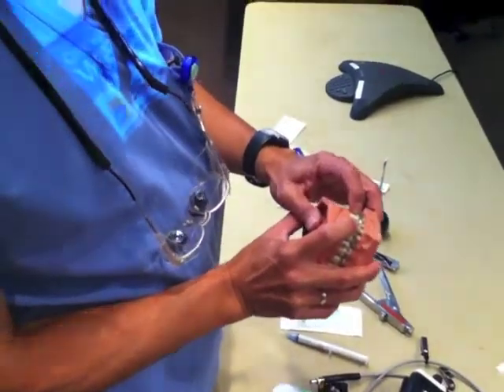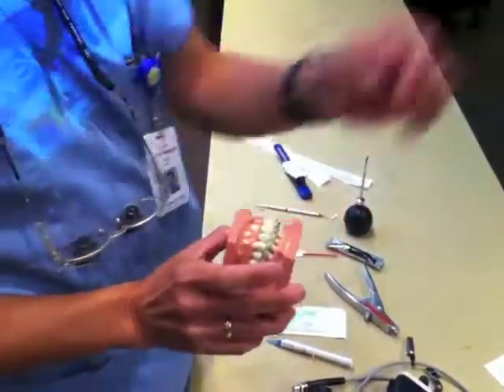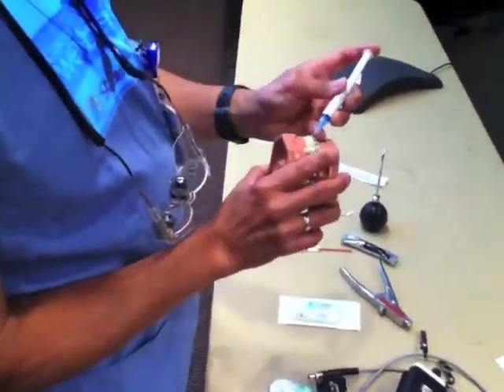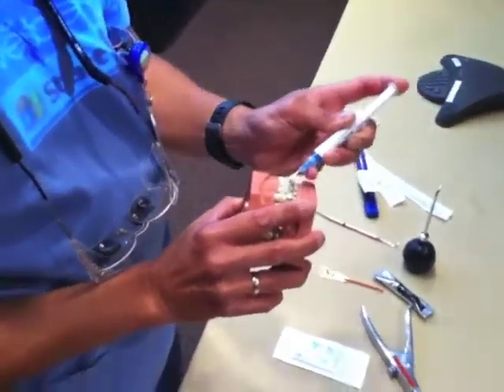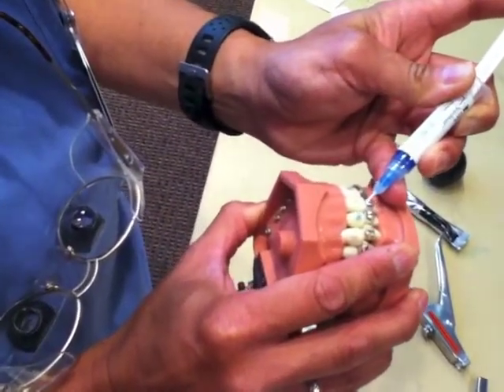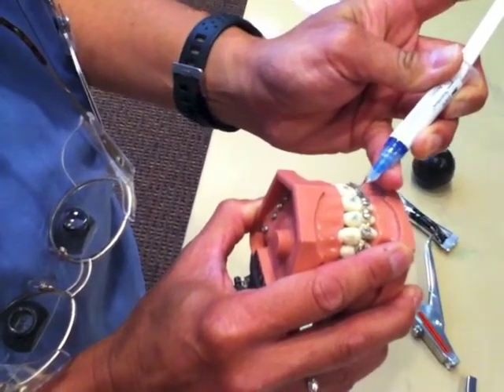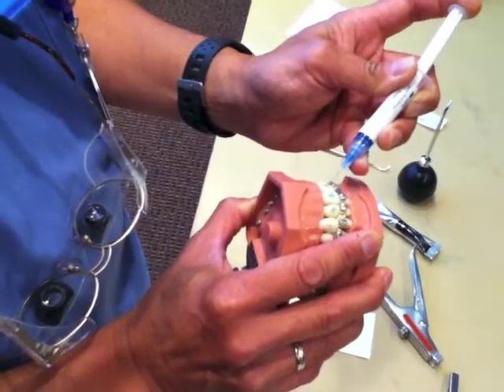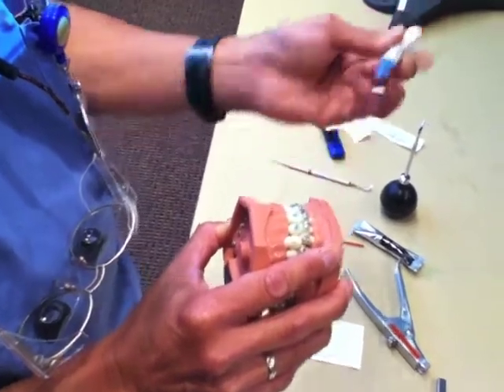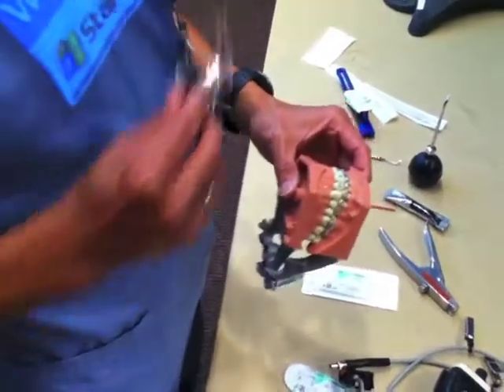For the avulsed central incisor: anesthetize the area, dry it off the best you can. What we're going to do is paint a little purple or blue material on the tooth — you're going to paint it on each tooth about in the middle third. Let that sit there for 15 seconds, same as the other system.